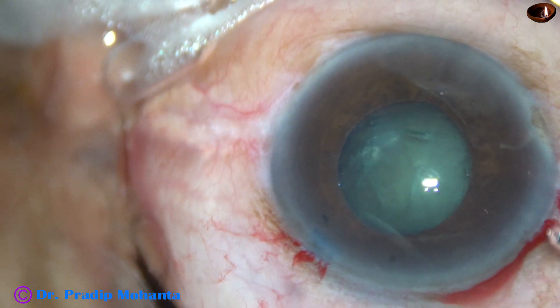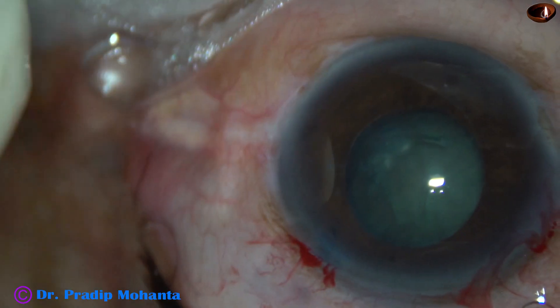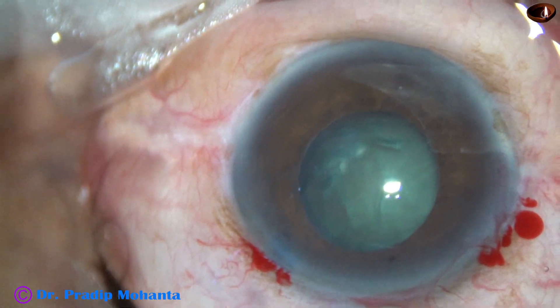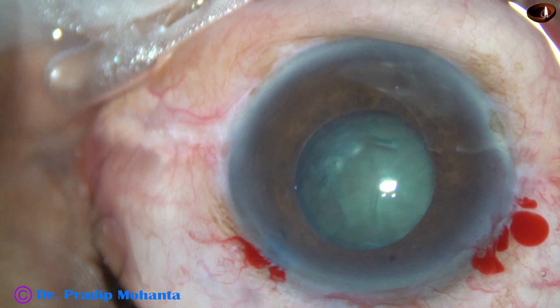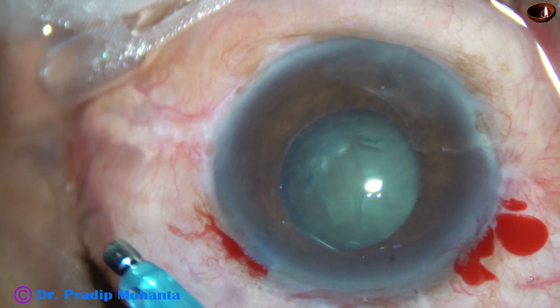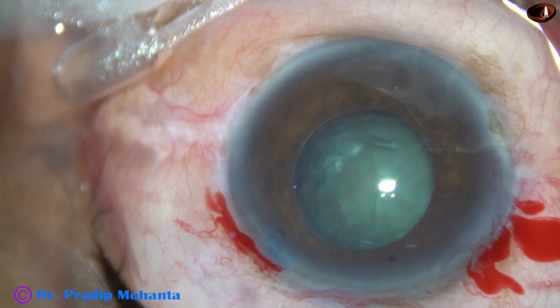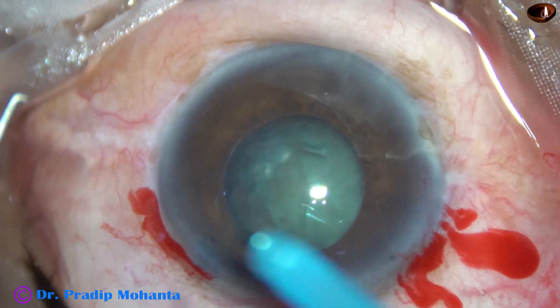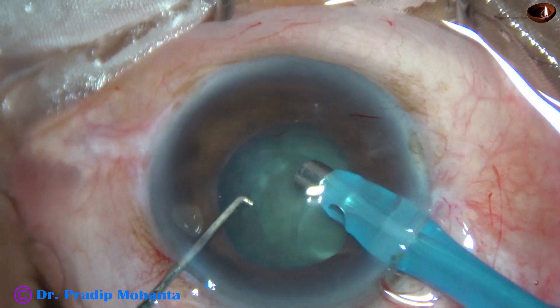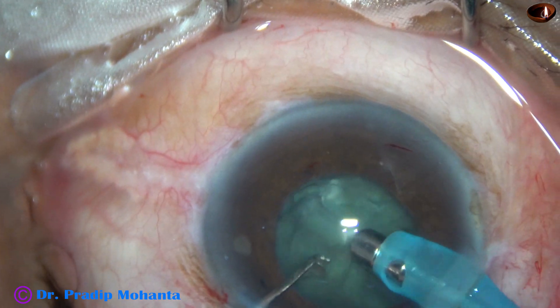Now I inject viscoelastic and plan to introduce the phaco handpiece. In this case, I have decreased the parameters: vacuum is 350 mmHg, flow rate is 35 ml per minute, and ultrasonic energy is 60%. Bottle height is less than usual.